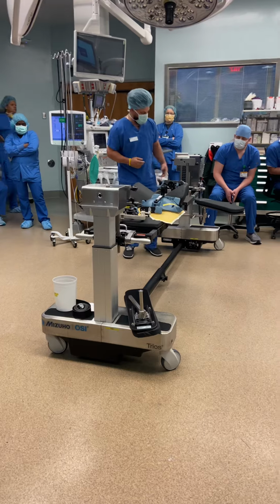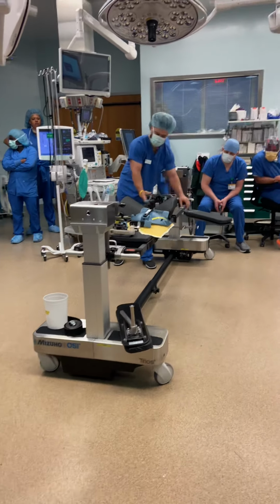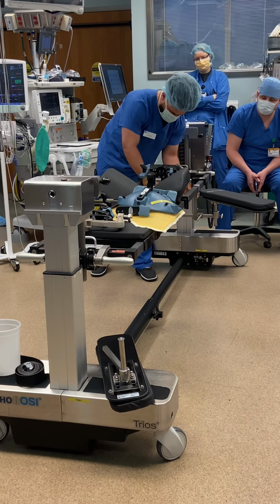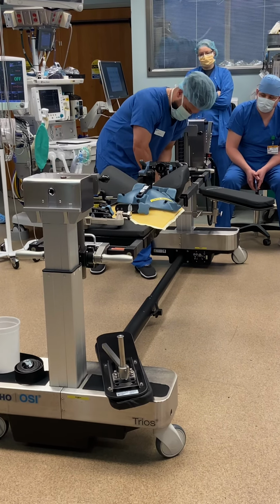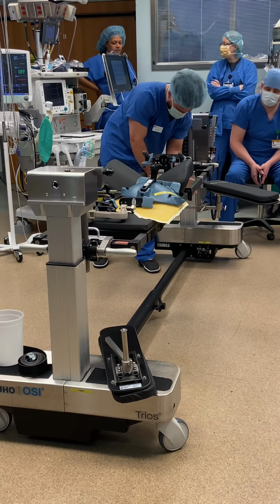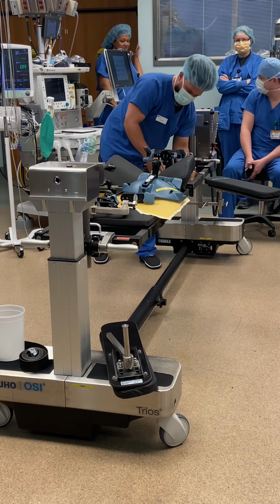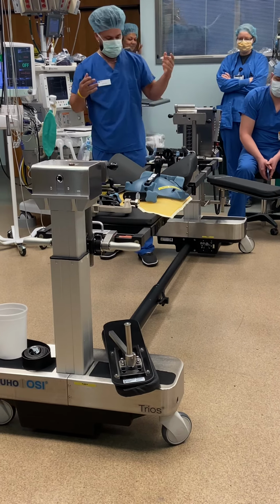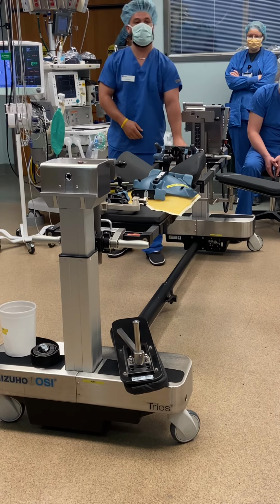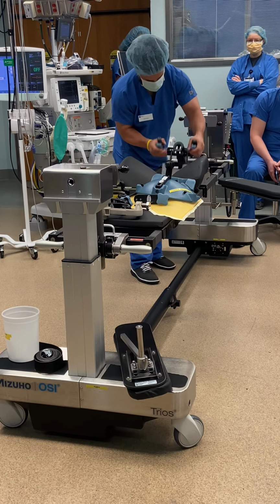Alright, so it is already mounted. As you can see, it's mounted through this little mounting system right here on the side. If you want to tighten it, all you have to do is screw in these little knobs right here. So I'm going to position it here. If you ever want to slide it from the right to the left, you would do it with these upward facing knobs right here at the top. So I'm just going to get right into this.